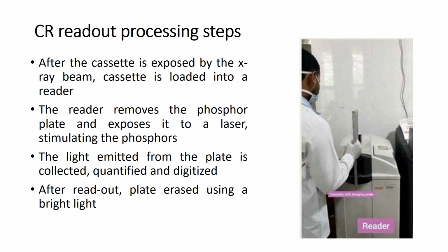Whenever the PSP plate is exposed to the X-ray beam, the cassette with the PSP is loaded into the reader system of the CR.